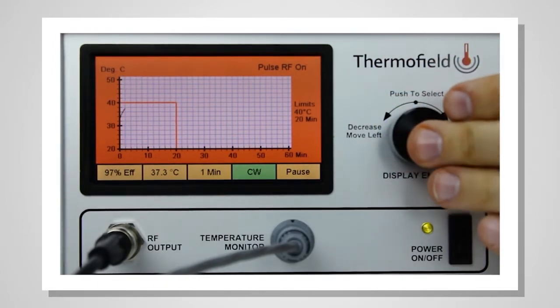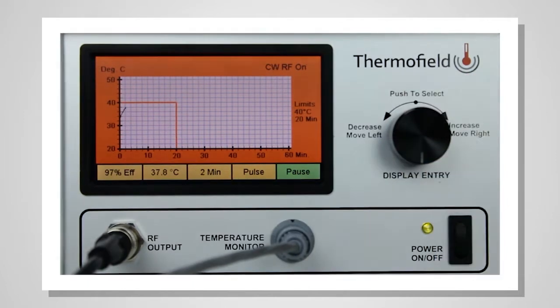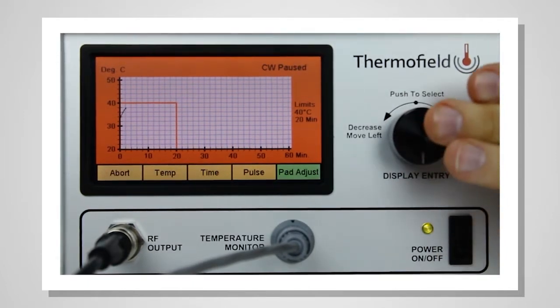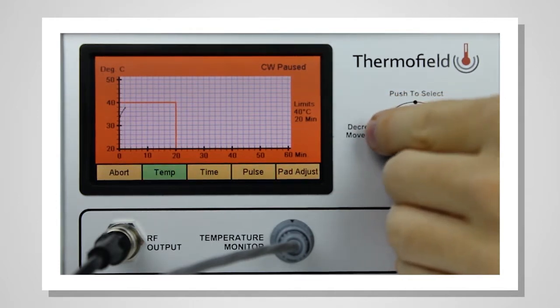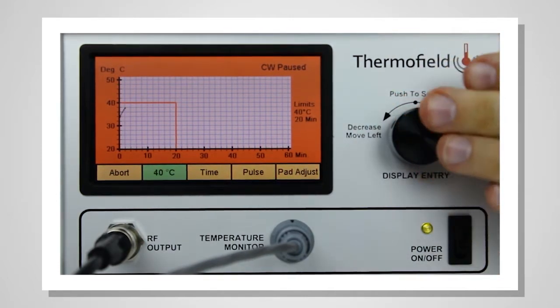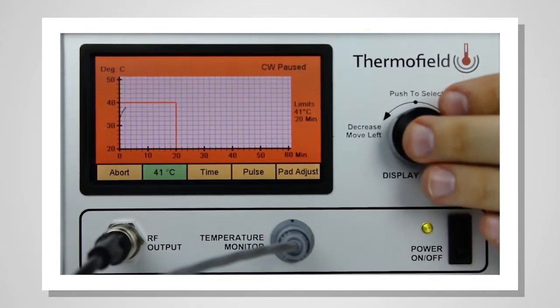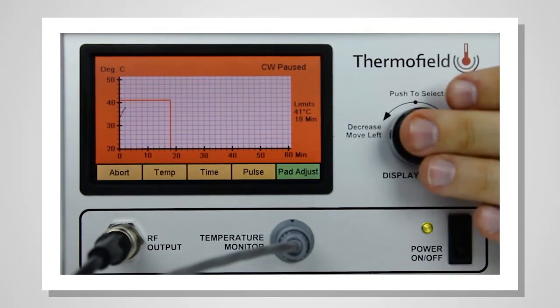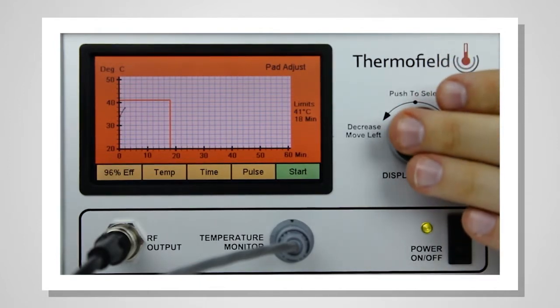To change the treatment temperature, time, or to adjust the pad, push the knob to pause the treatment and rotate the knob to select a pane to adjust. After adjusting the treatment, return to the PAD ADJUST pane. Push the knob to reach the best efficiency and push the knob again to continue the treatment.